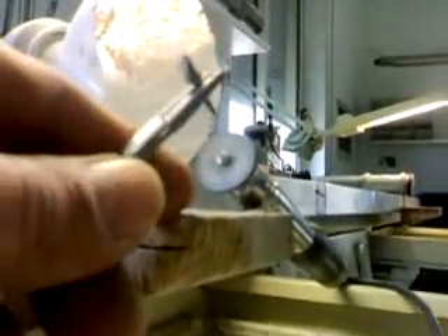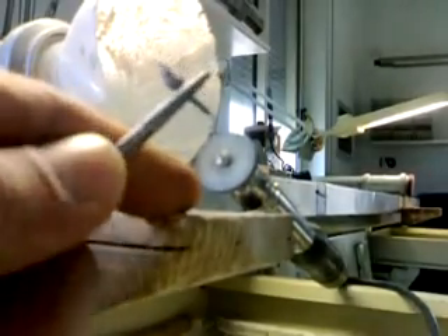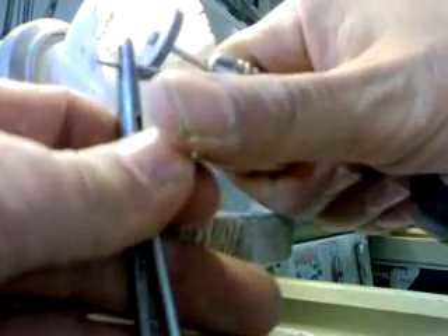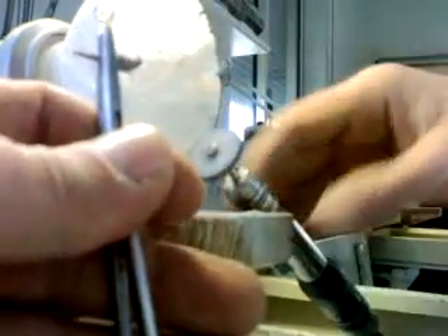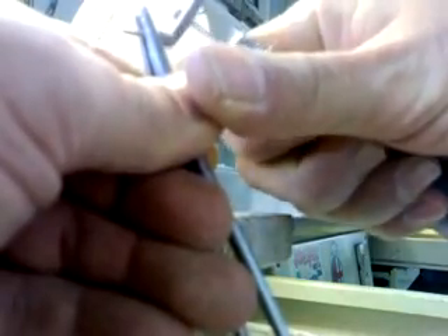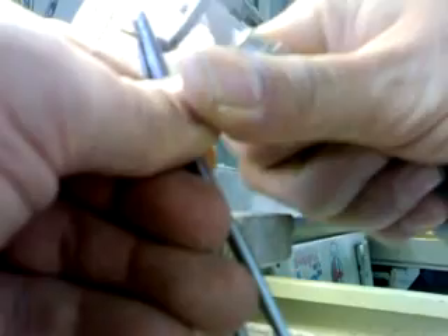We get ready with our heatless stone to trim off the upper part of the sprue, once we have cut the post core off the sprue. This is the procedure I use — a heatless stone. I tend to hold it with a hemostat because it gets really hot.